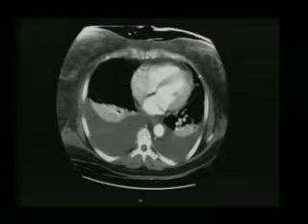Sometimes you can get an endoleak from big intercostal arteries. Usually they are very small because there's no stenotic lesion or atherosclerotic disease in the aorta itself. So it all depends on how much aorta you're covering. Risk of paraplegia goes high if you're covering more than 20 centimeters of aorta. Risk of paraplegia goes high if you're covering the subclavian artery, because the vertebral artery comes from the subclavian artery. That gives the anterior spinal artery.